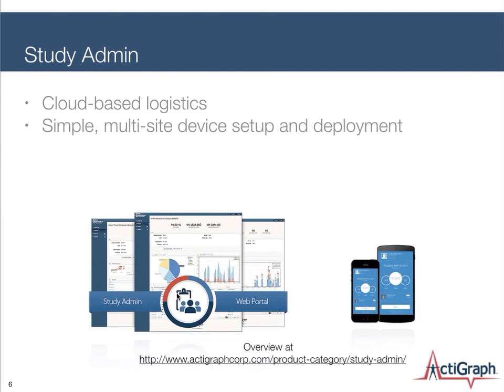It's focused on simplifying your device deployments, and it also simplifies multi-site device deployments in particular because of the reduction in the requirements for setup of a device. It really allows you to pre-configure that for all of your sites, manage your sites from one web portal, and just make it a lot easier on your data collectors.